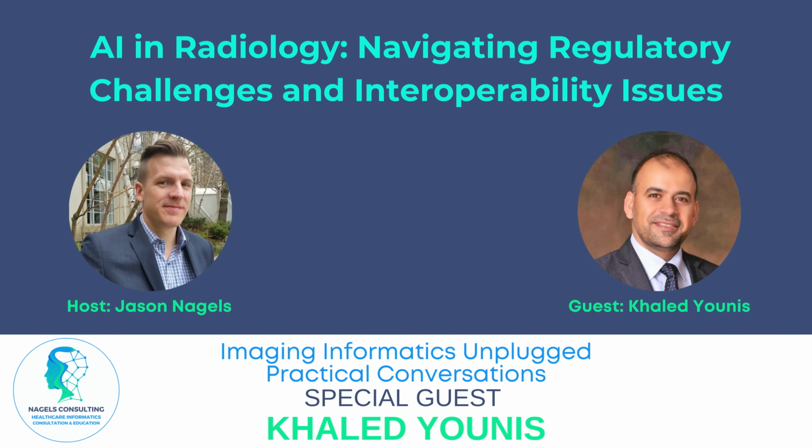So we try to build in the adherence to the IHE profile, and it is on us to participate in the IHE Connectathon, which we do actually. We did that, and now vendors or enthusiasts can take a solution that is already compliant with the IHE profile recommendation.